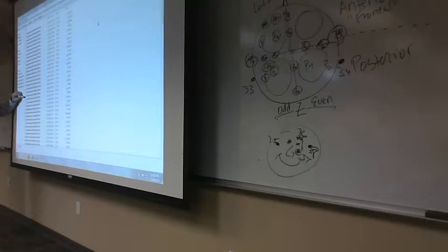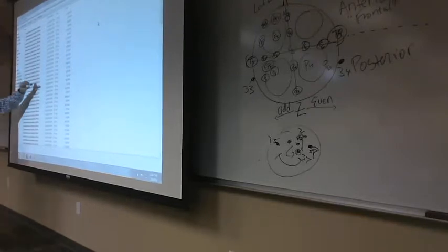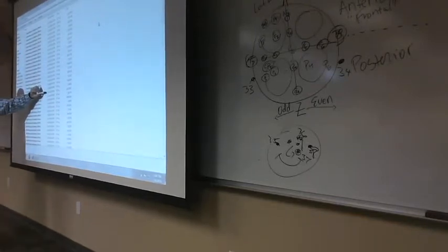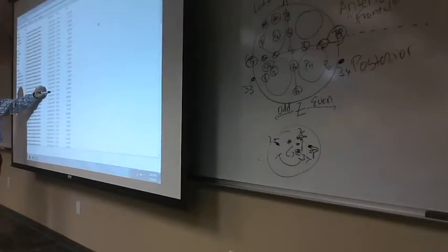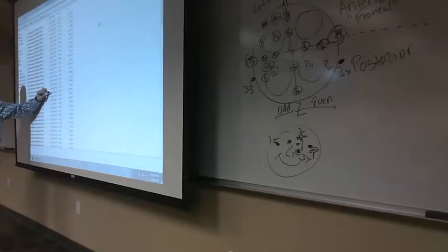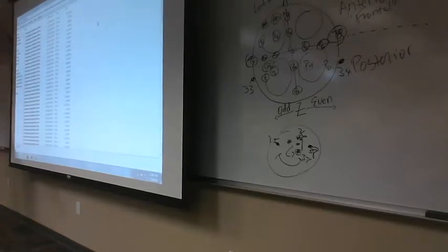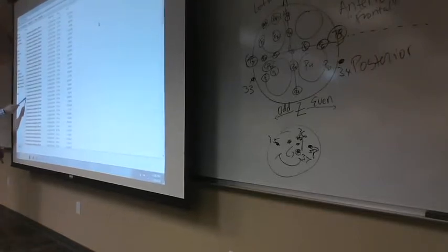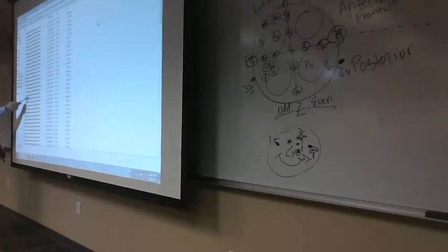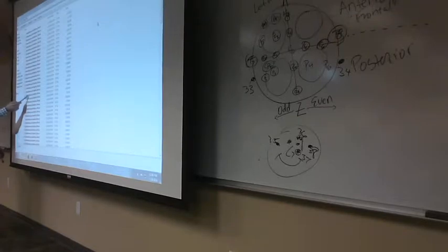If you'll notice, remember I said to use really intelligent naming features so that you can revisit this. I did this back November 1st, 2015. Quite some time ago. I haven't touched this stuff since then, so I forgot whatever was done, right? But I know exactly what was done because we've labeled it the same way that we practice labeling your files. So subject 12 was re-referenced to the average of the mastoids. Okay, so re-ref to mastoid.